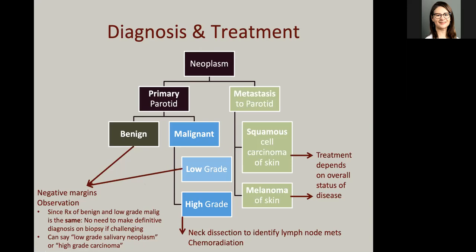So we maybe just say low-grade neoplasm, or conversely, high-grade carcinoma, because that's where the clinical decision-making branch point will occur. If I'm incorrect, please let me know, because we like to know how the treatment algorithms change so that we can better provide diagnoses. But up until now, this is sort of how we've been functioning.